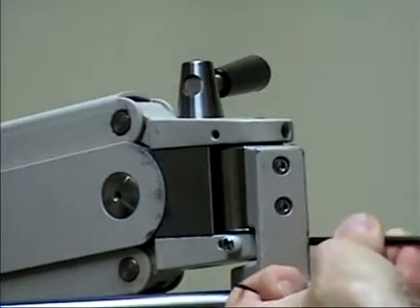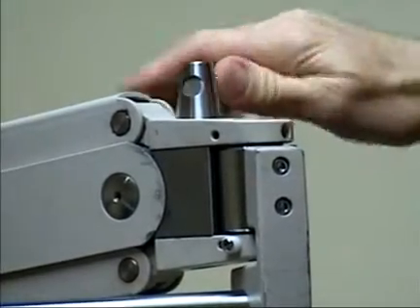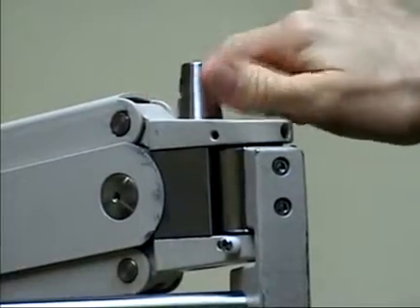Also part of the adjustment is to get the top and bottom evenly adjusted, so you're not getting a lot of up and down motion of the section of the phoropter arm when you tighten.